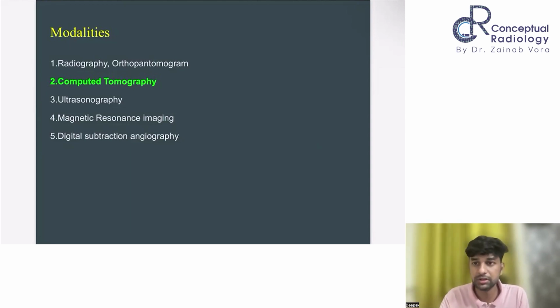So in that you can very well appreciate the nasal fracture if it is present, and OPG, especially in mandible fractures. If the patient has a low energy trauma and presents to the dental department, they usually do an OPG first, and then if they are suspecting any other fracture, the patient comes to the emergency department or the radiologist.